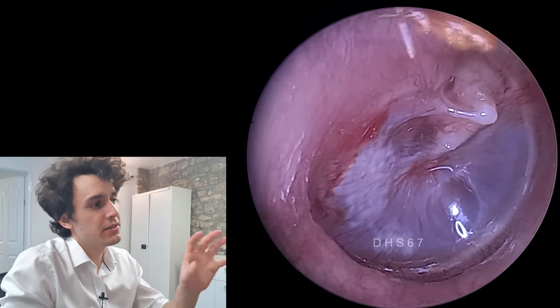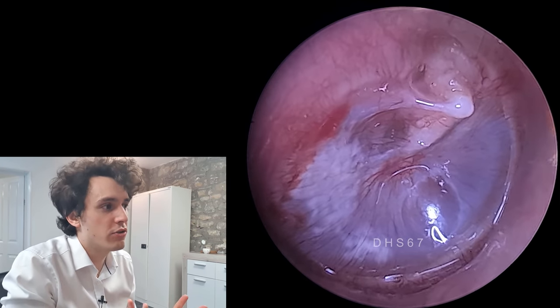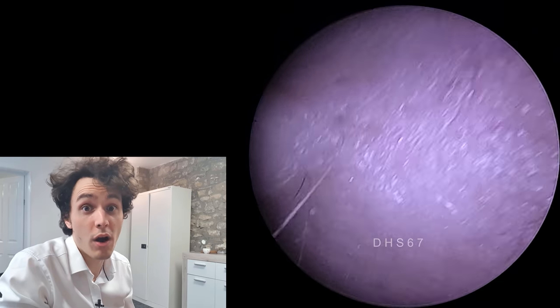Although the eardrum doesn't look pretty in the traditional sense, it doesn't look too bad, but a follow-up with ENT is required.